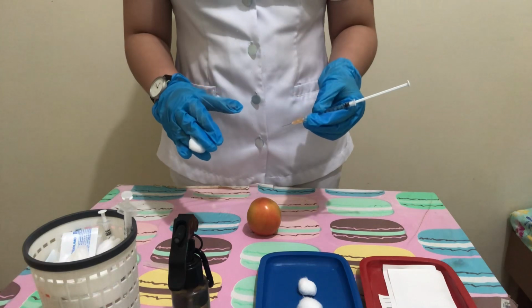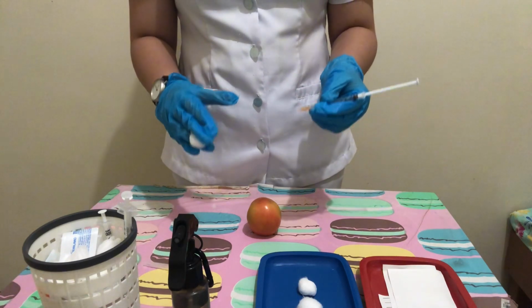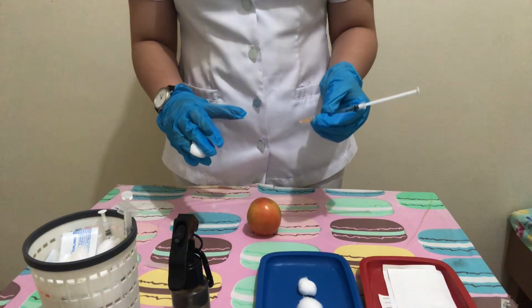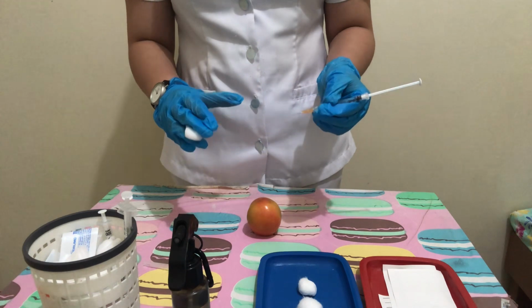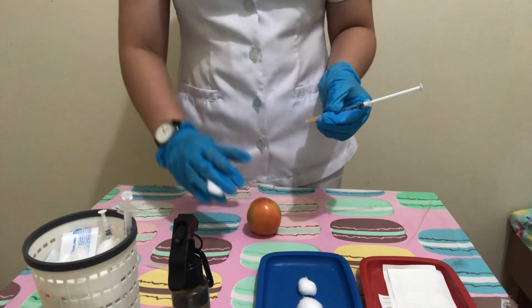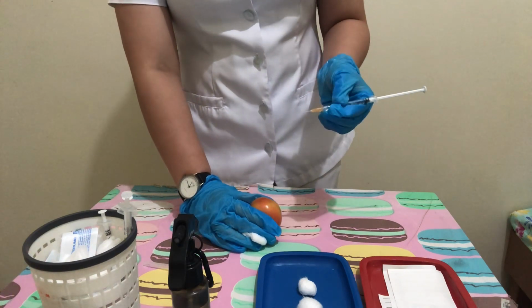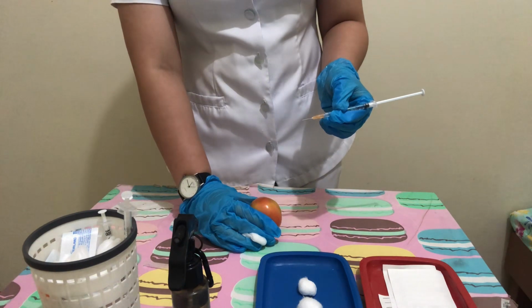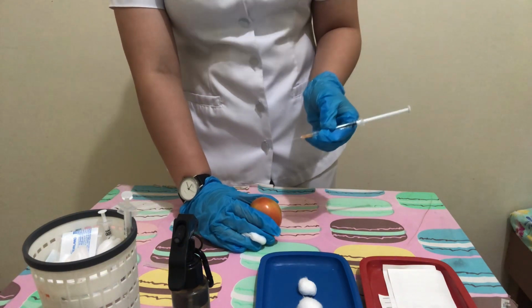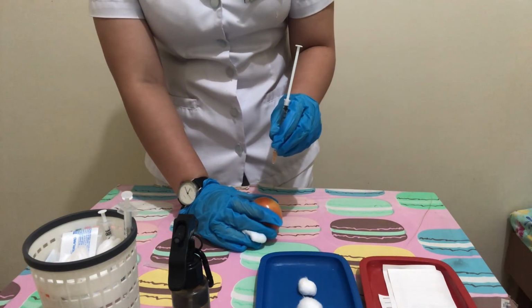So to give the injection, we're going to use the Z-track technique. So what this technique does is, number 1, it decreases the pain for the patient, and it helps prevent the solution that we're instilling from actually going into the subcutaneous tissue. So place the ulnar side of the non-dominant hand below the injection site and pull the patient's skin laterally about 1.5 inches, holding the position until you insert the needle. So do it quickly to cause the patient less pain.